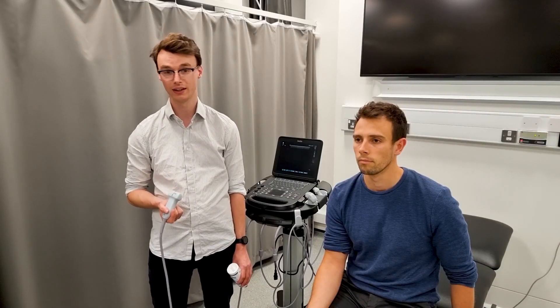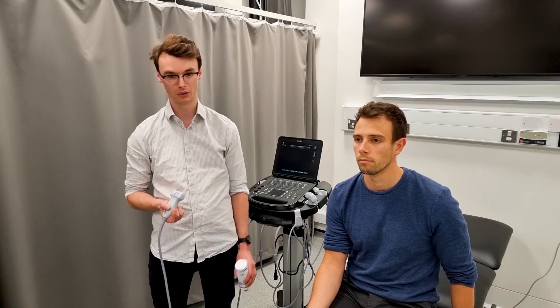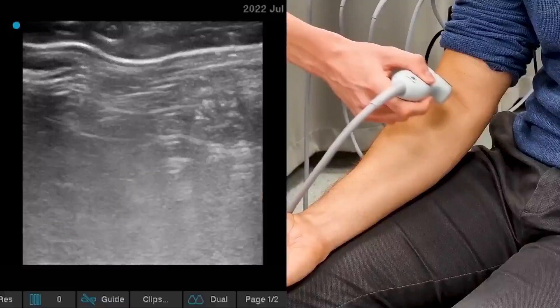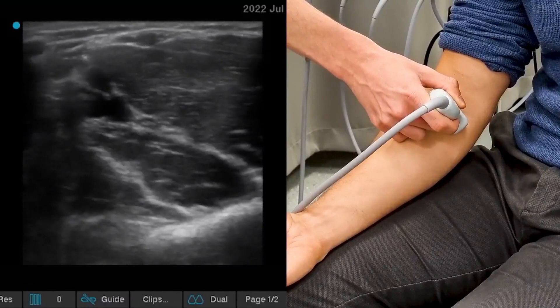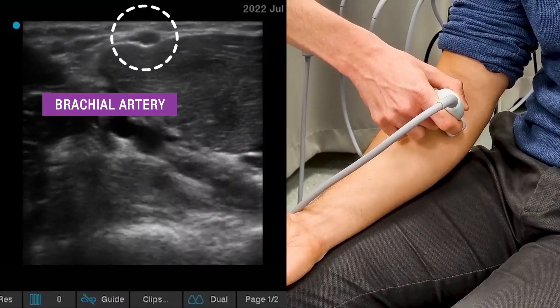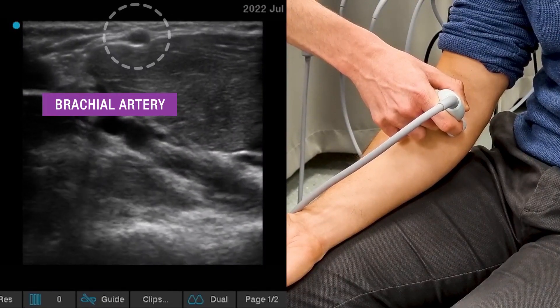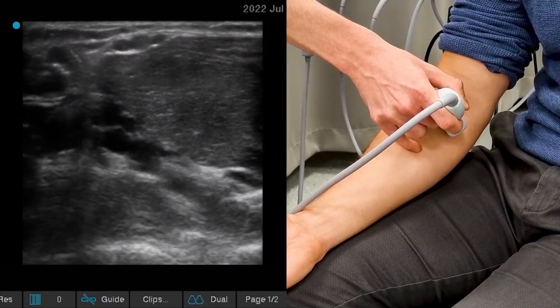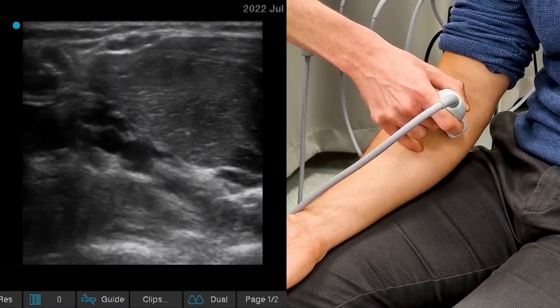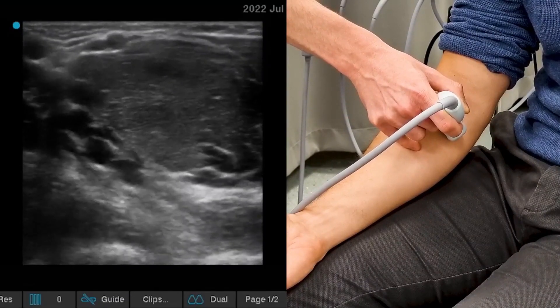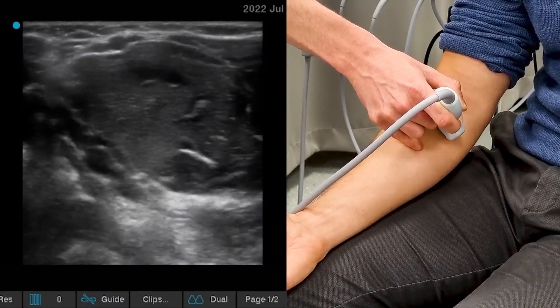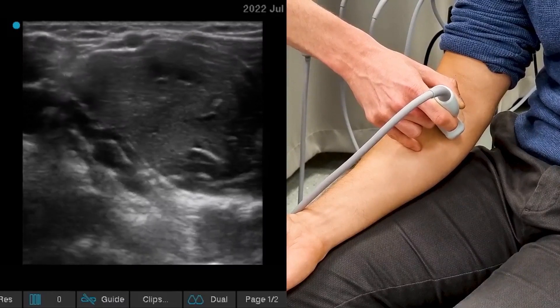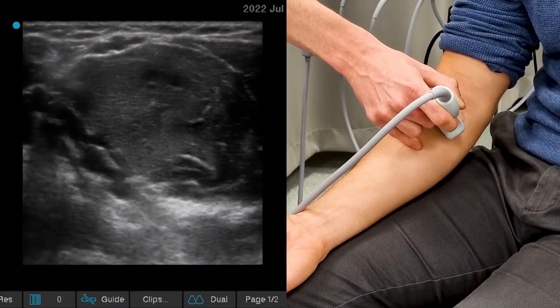Now we will move on to demonstrating ultrasound of the antecubital fossa and the anterior forearm. On initial ultrasound of the antecubital fossa, you can quite nicely see a pulsatile vessel at the top of the screen — this is the brachial artery. If I release the pressure slightly, either side of the brachial artery you can see two more lumens appear. These are veins, and we know this because they are easily compressible as I change the amount of pressure on the probe. The main clinical use of ultrasound of the antecubital fossa is for obtaining intravenous access in challenging situations, and using this view we can cannulate one of the veins on view reasonably easily.